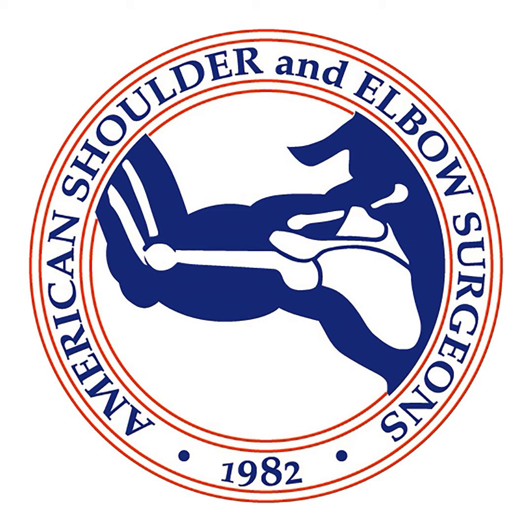Dr. Wiater, how about you? How do you manage the subscap when you go stemless? So I guess this is one area where John and I differ. I do a lesser tuberosity osteotomy on my anatomics, whether it's a stemmed or a stemless implant. On my reverses, I'll do a tenotomy just because it's quick and easy. And as you know, if the subscap doesn't heal well, it doesn't really impact function much. But certainly with an anatomic, it's critical. So I like the LTO because of the bone-to-bone healing.